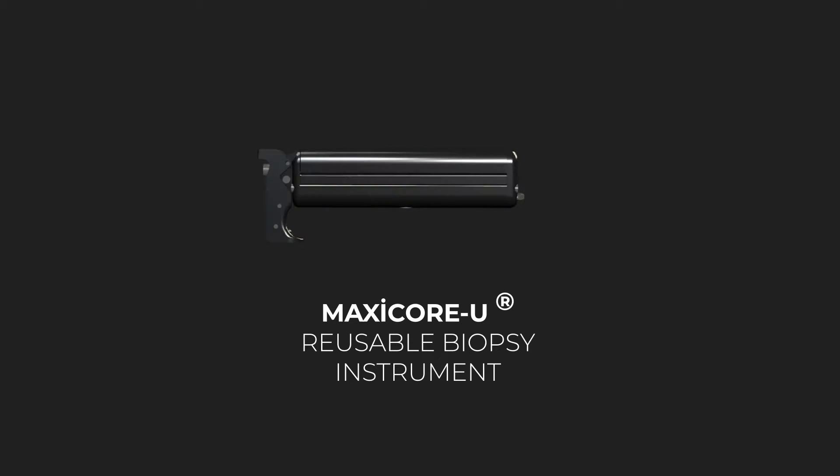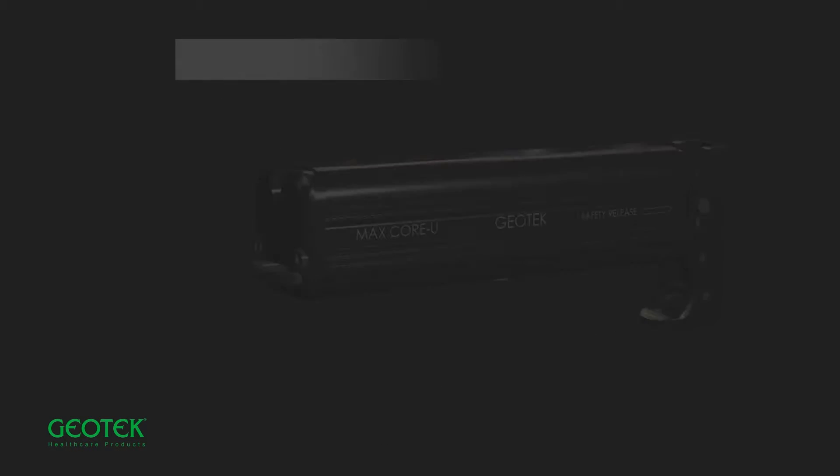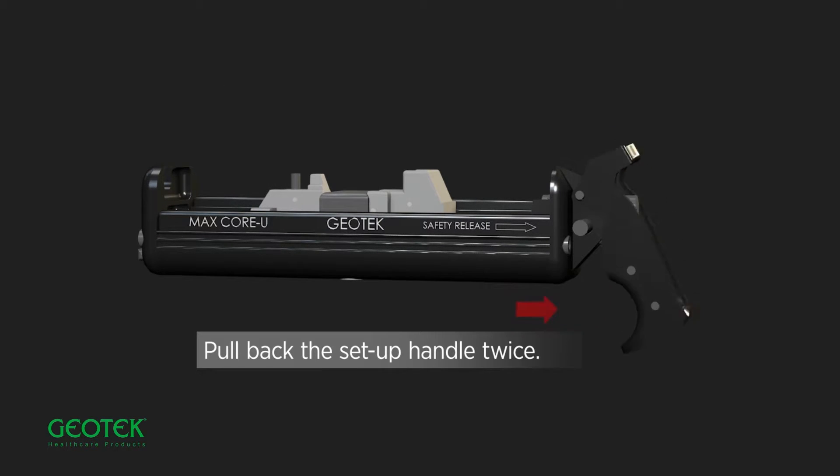MaxiCore U Reusable Biopsy Instrument. Release the safety before installing. Open the cover of the gun to insert the needle. Pull back the setup handle twice.